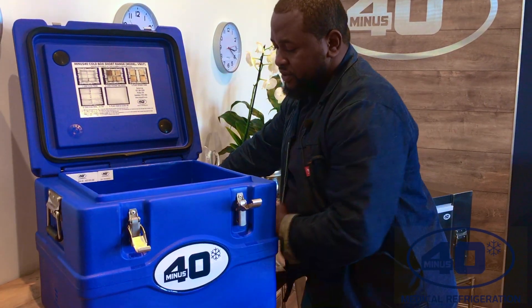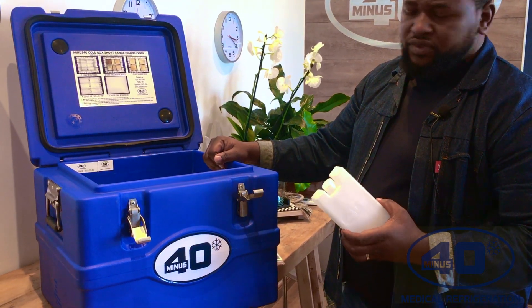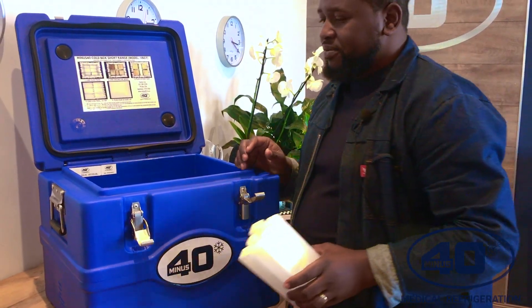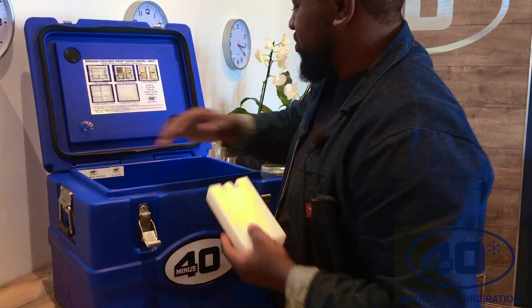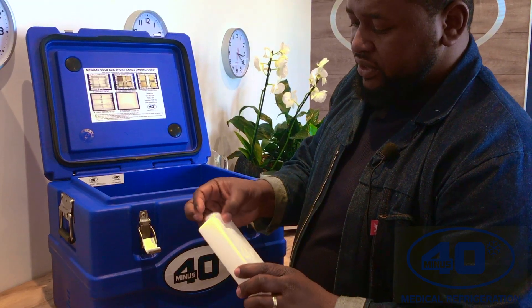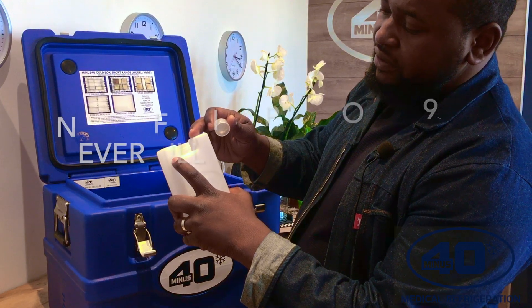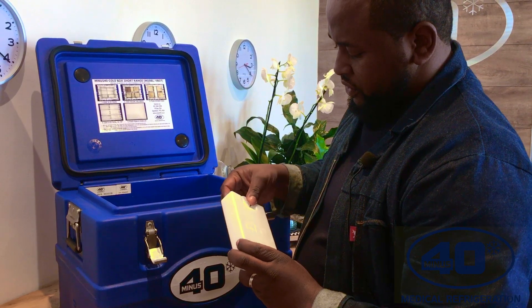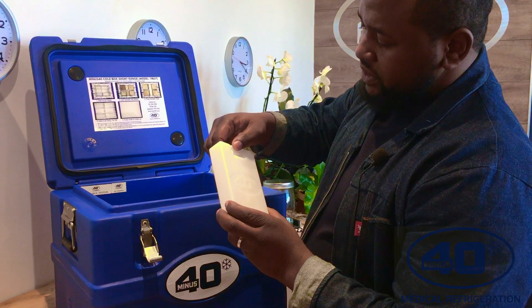So what I will do now, I'll do a demo on how to pack your vaccine cold box. I'll remove all 24 ice packs. You'll see it's also a minus 40 product. What you do is you have to use just tap water to fill them. There's also a fill line right there, so you're never going to overfill. You just have to make sure that you secure the cap so that the water does not leak.